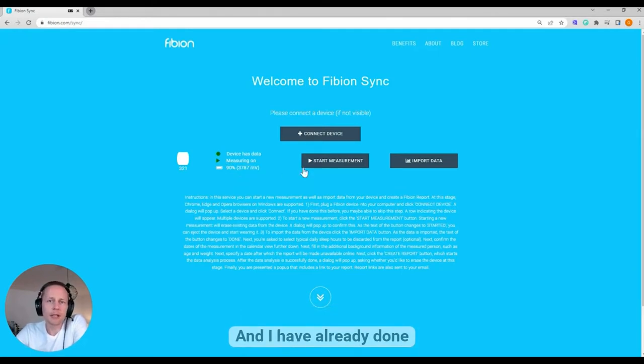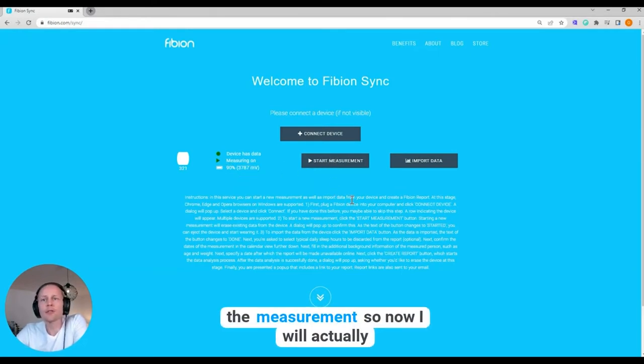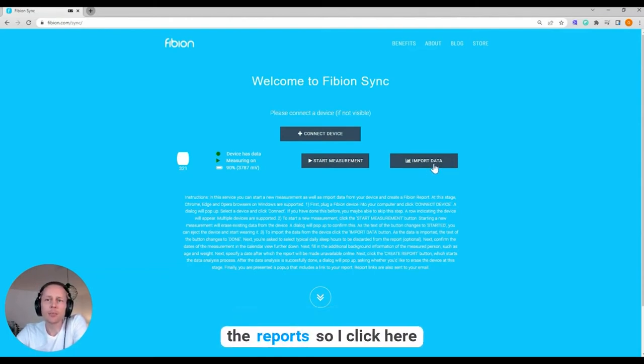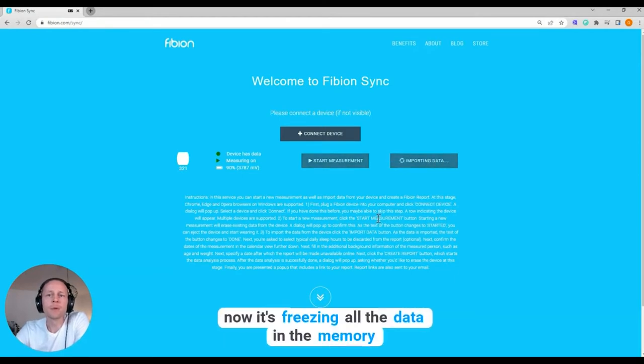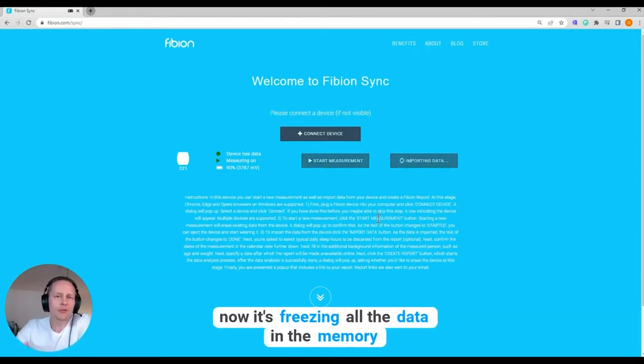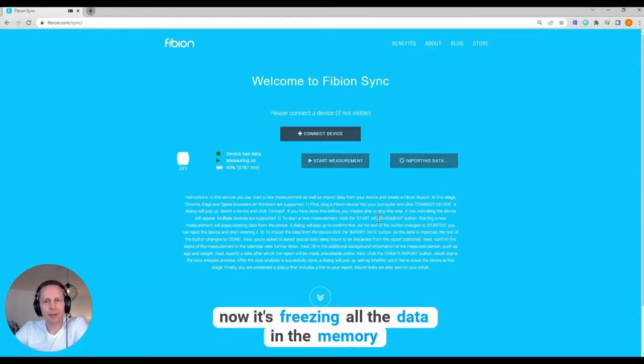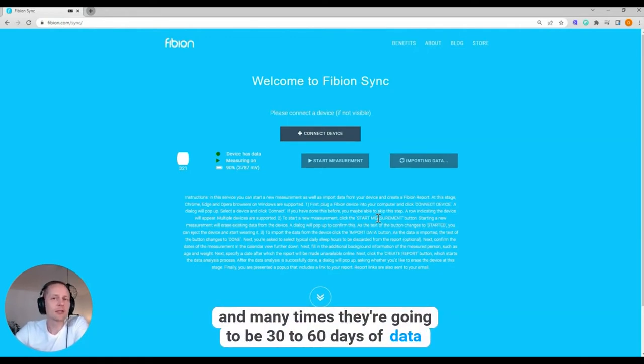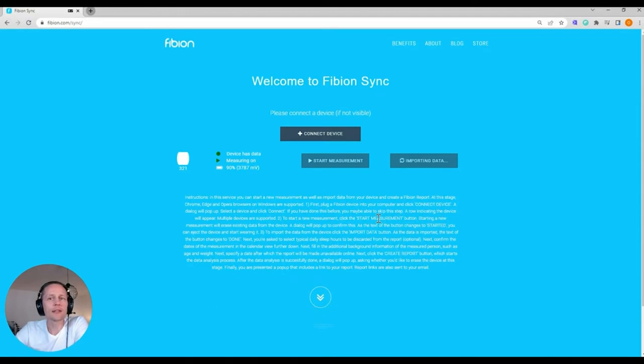And I have already done the measurement, so now I will actually look to import the data and create the reports. So I click here, now it's reading all the data in the memory and many times there can be 30 to 60 days of data.